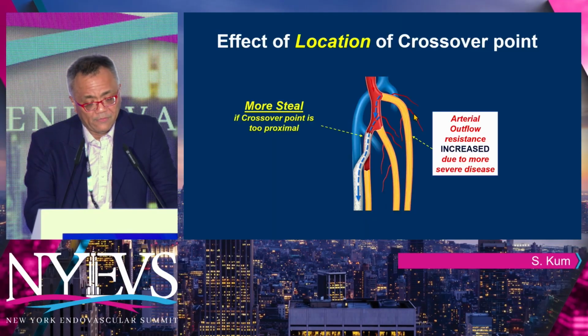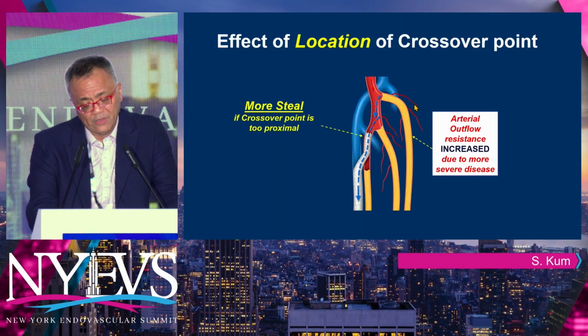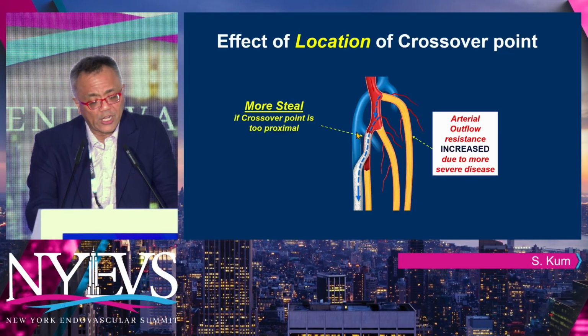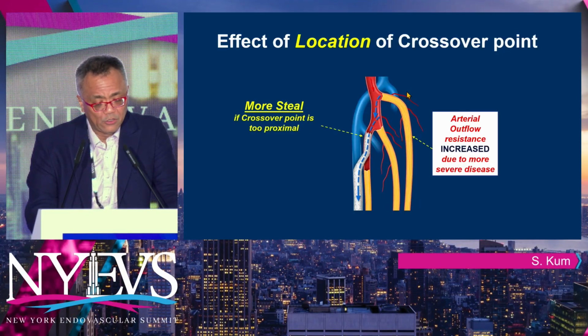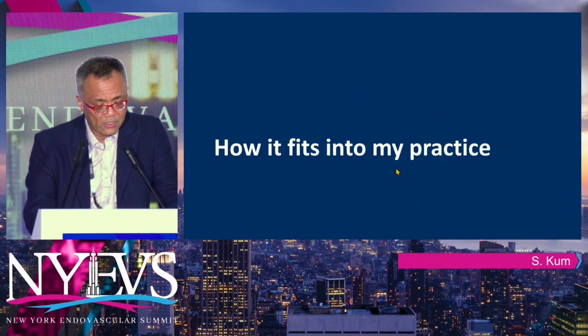If you have a patient who is severely occluded and only surviving on collaterals, and you had an excessive amount of shunt with a very generous crossing stent, the blood would always preferentially flow into the venous circuit, and this could potentially steal blood from existing collaterals. In these kinds of cases, you want to cross a little bit more distally.